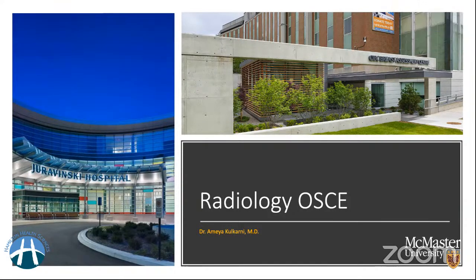Okay, so I'll start with my cases here. I have just compiled about 5 interesting cases with different scenarios. There is no specific system distribution or specific areas which we are going to focus on. We are going to look at cases which are a combination of things which you might run across. And I have tried to compile at least one teaching point per case. So without any further delay, let's start with the first case here.